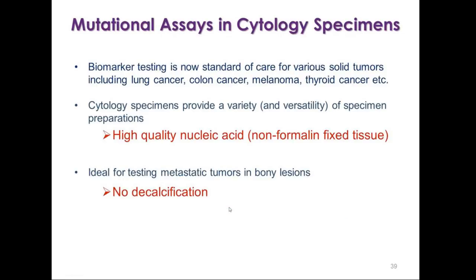So let's talk a little bit about the mutation assays in cytology specimens. As we're aware, this is increasingly becoming standard of care for multiple tumor types. And cytology specimens are great in terms of mutation assays because there are a wide variety of different specimen preparations, and because there's a wide variety, there's also a lot of versatility.